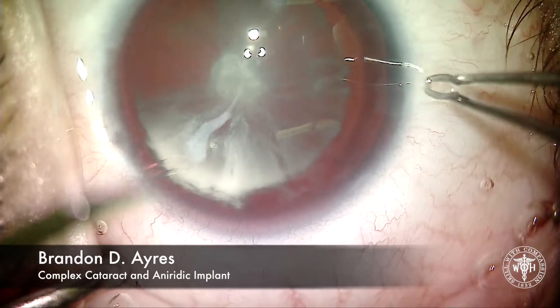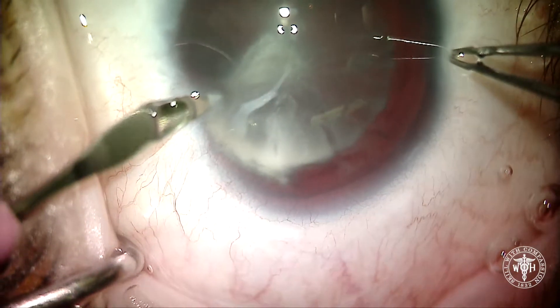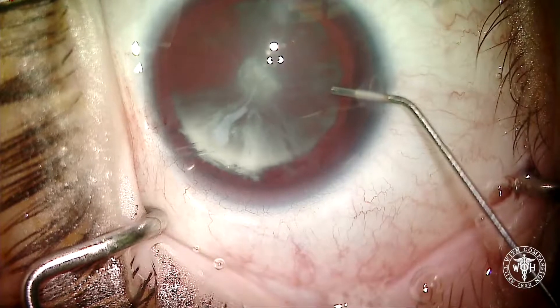This is a video showing artificial iris placement as well as cataract surgery in a 15-year-old with aniridia. She's already had a tube shunt placed due to uncontrolled glaucoma, and that tube shunt seems to have accelerated the cataract, so it's time for us to try and get things repaired.